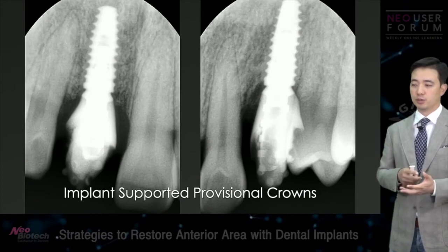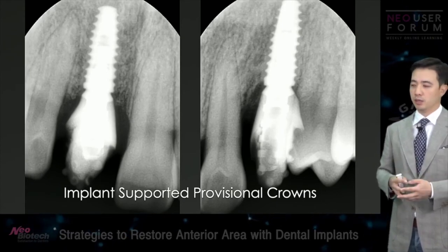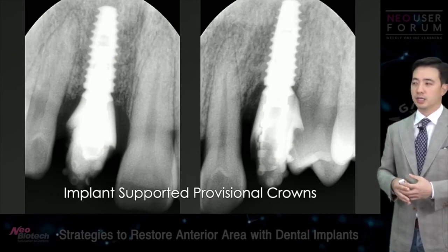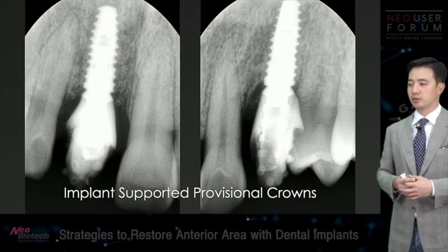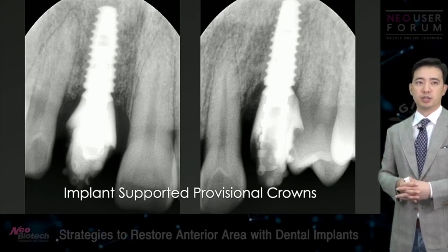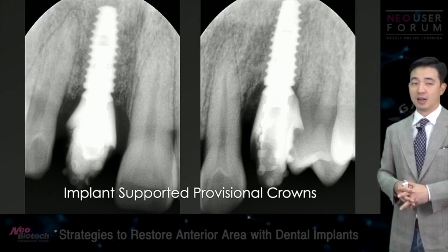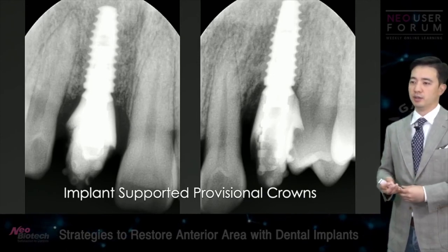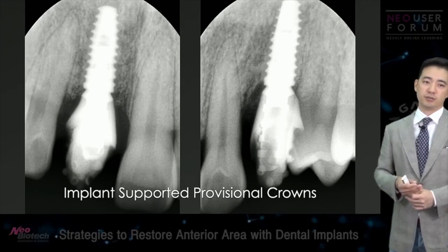Okay, and for number 12, it really worked out well. For 22, it was unfortunate that it had to fail, but even if it did fail, I didn't really do that aggressive of surgery to recover from that. So I don't think that I have lost that much trying the socket shield technique for that case, okay?